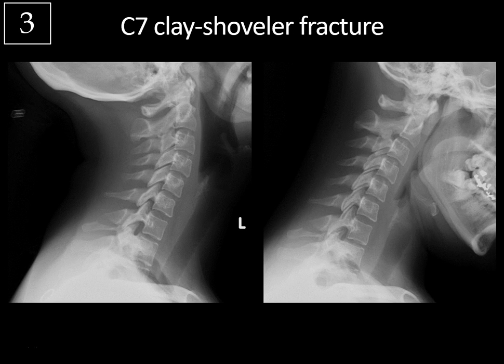A clay shoveler fracture is any fracture of the spinous process of a lower cervical vertebra. These are best seen on lateral radiographs and are often displaced. This one gets slightly more distracted on the flexion view, and C7 is the most common location. Originally described in clay shovelers whose shovels got stuck in sticky clay — when they attempted to shovel against it, they got a sudden flexion force on the neck causing this fracture. We now see this more commonly with trauma like MVAs.